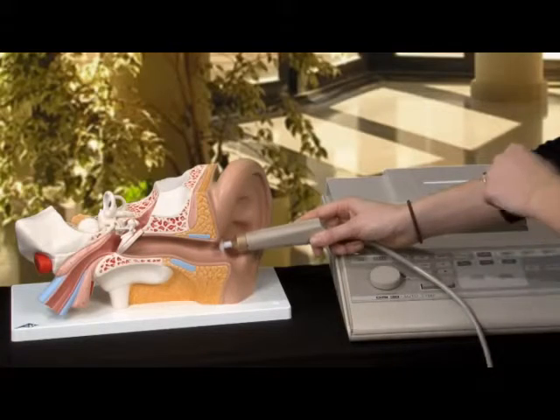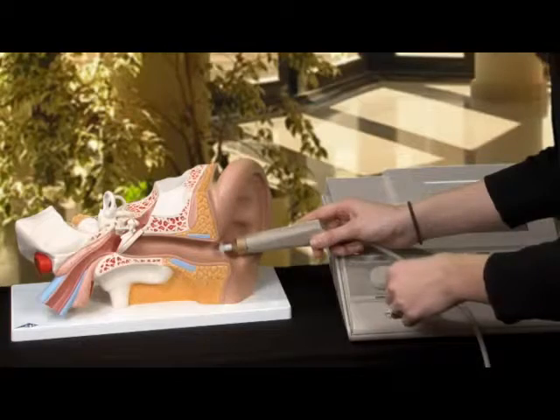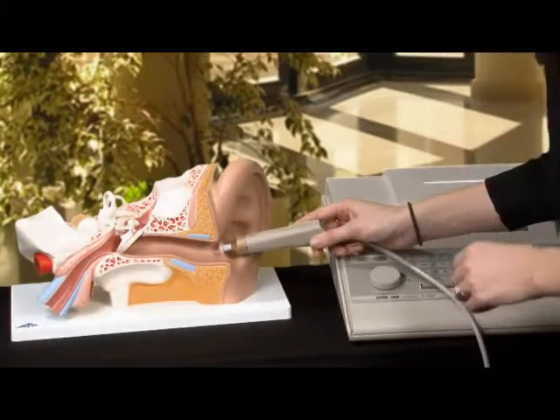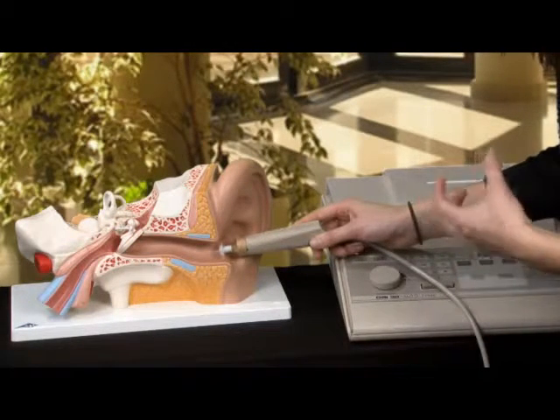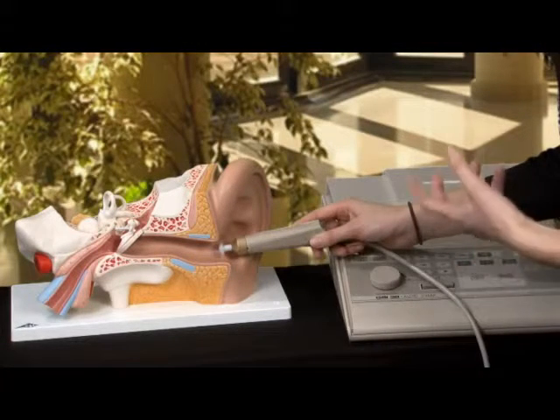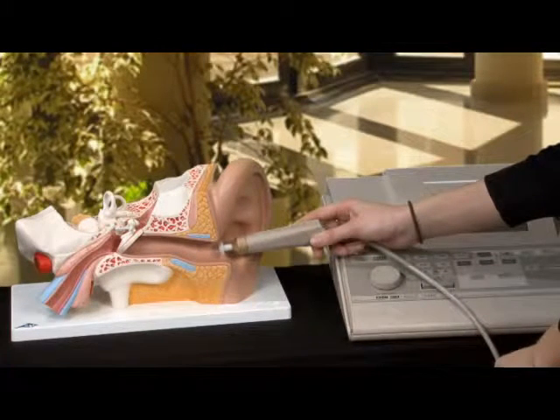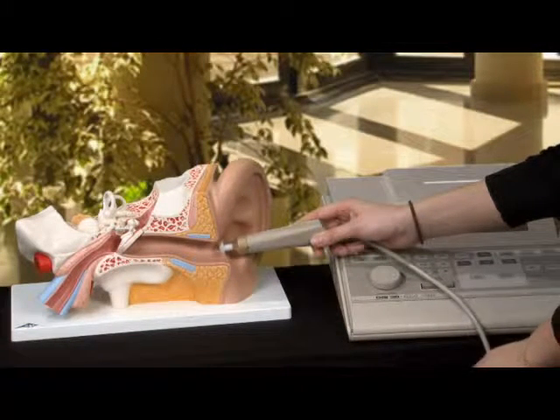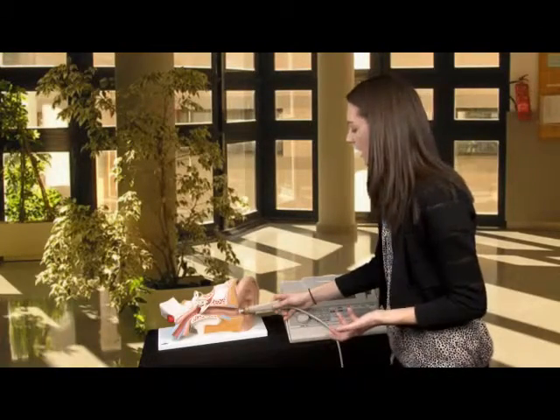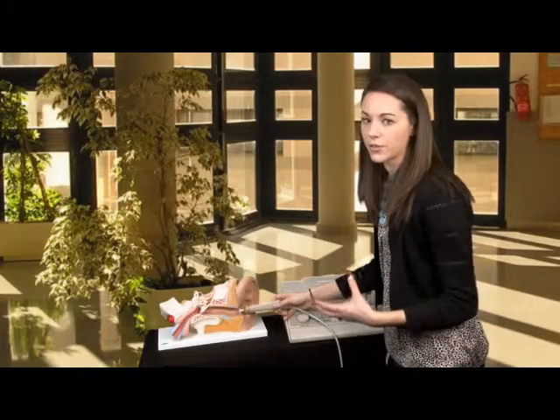A low-frequency tone will be presented into the external auditory canal. It'll travel through it, hit the tympanic membrane, and some sound energy will be absorbed by the middle ear and travel into the inner ear. Some sound energy will be reflected back and picked up by the microphone in the probe. Basically, we are assessing the efficiency of sound traveling through the middle ear.